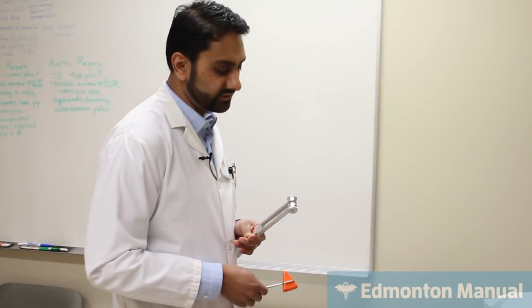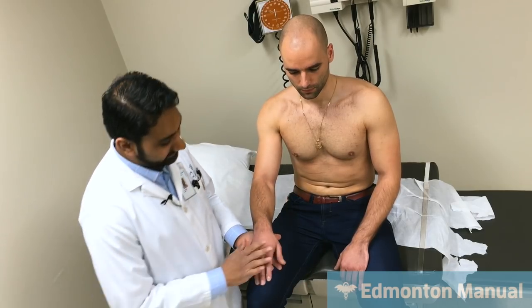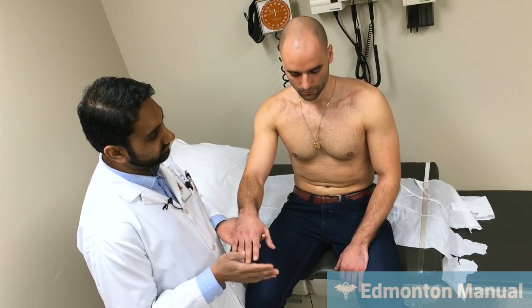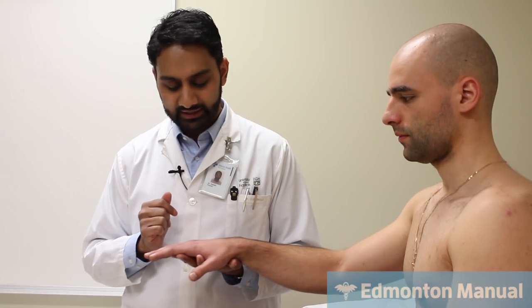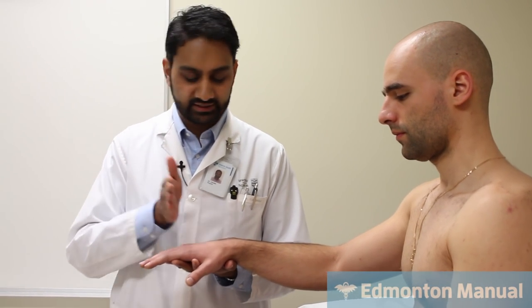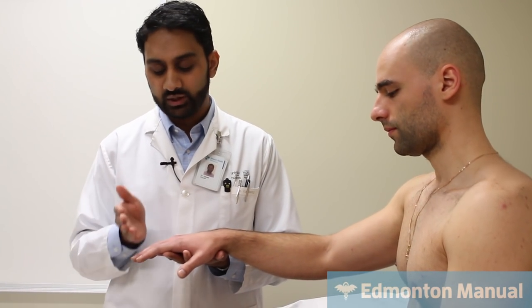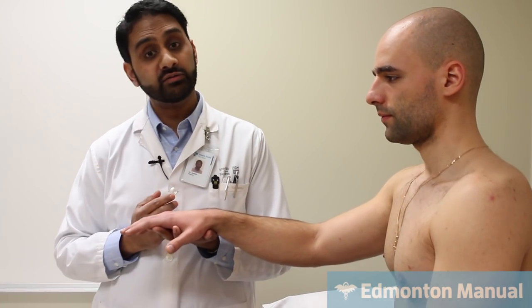Now, the way you do it is, I'm going to take your hand. Ideally, you would actually start on the feet, but for sake of this demonstration, we're just going to do the upper body. For most neuropathies, and that's generally what will be the common thing that will affect the transmission of vibration sense, it'll start most distally, and as neuropathy progresses, it'll move proximally, okay? So what you want to do is test distally, and if it's intact, you're pretty much done. Whereas if there's any problems, you keep moving proximally until you find the area that they can feel.